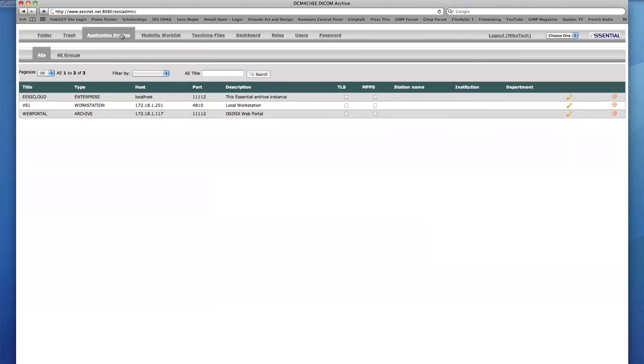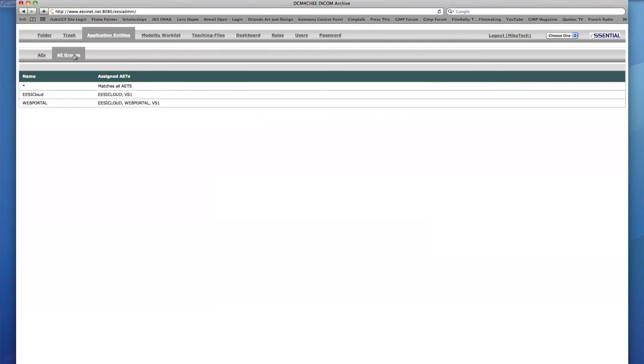In the Application Entities tab, the new AET icon is not available, and so Mike Tech cannot create any new AE titles. He also cannot delete any of the titles. Under the sub-tab AE Groups, this user can only view the groups and cannot edit, delete, or add any groups.